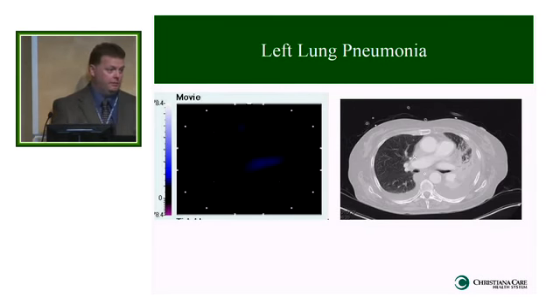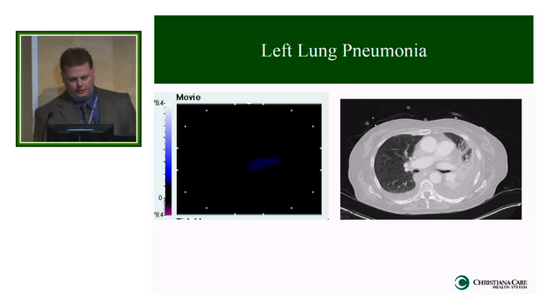The patient de-recruited this whole quadrant of their lung. Again, I know I have an x-ray there, but think of it as a CAT scan. They de-recruited that whole dependent area there. This is that same video, after they realized that they de-recruited the patient. They went up to 12 of PEEP to re-recruit them, and you can see that area there nicely re-recruited on 12 of PEEP, and thus the patient was deemed not ready to come off the vent.